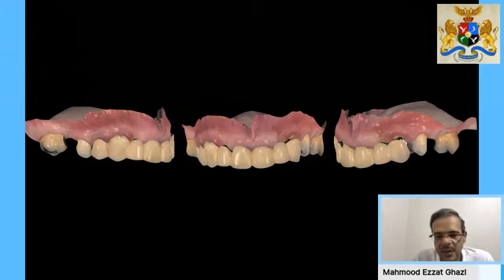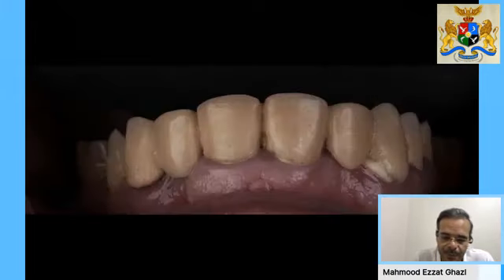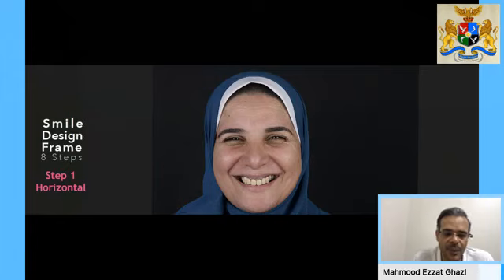These are the intraoral scans of the patient, the intraoral photos. You can see, of course, the papilla deficiencies that we have in the case, the unequal papilla tips and gingival margins, and how challenging the case was. So quickly, an overview about the smile design and its relevance and how this can be done.